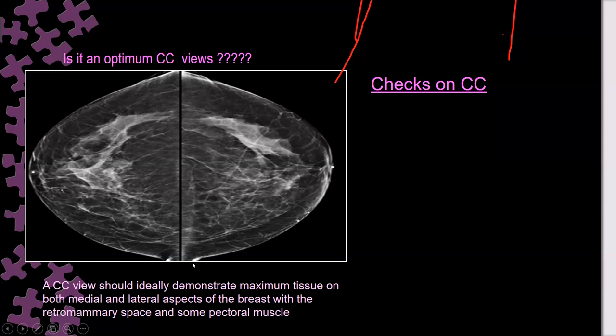But laterally, we are not seeing the cleavage. The cleavage is seen medially due to the area of the cleavage between the two breasts, the valley of the breast. We'll see that medial cleavage. It's okay. Accept it. What else? Do you have any other comment?